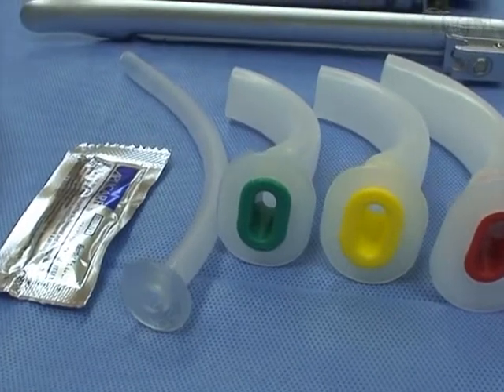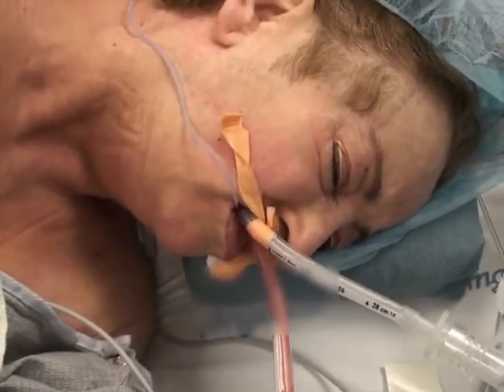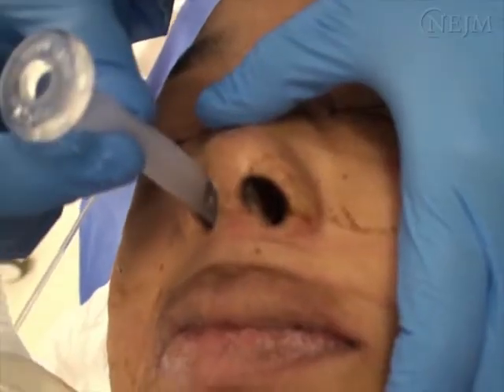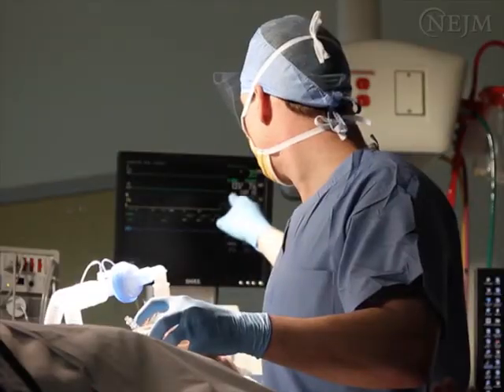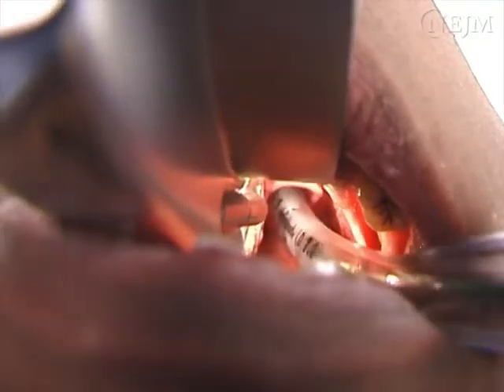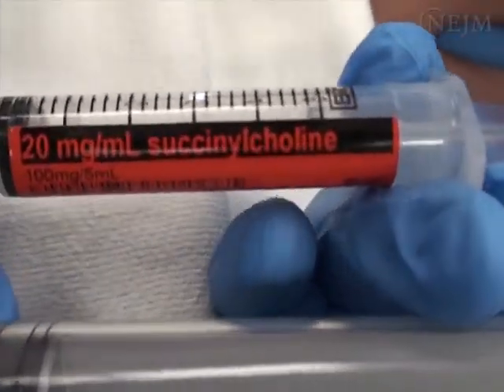Equipment selection is guided by the need to prevent complications and to maintain airway patency, oxygenation, and ventilation. A suction device for removing airway secretions, supplemental oxygen, and an appropriately sized face mask with a bag valve device must be immediately available. Oropharyngeal and nasopharyngeal airways should be readily available in case one needs to be placed to improve airway patency. The patient's vital signs should be monitored continuously. A laryngoscope, endotracheal tubes, and stylets should be available in case immediate reintubation is necessary. An induction agent such as propofol and a muscle relaxant such as succinylcholine may facilitate emergency reintubation.